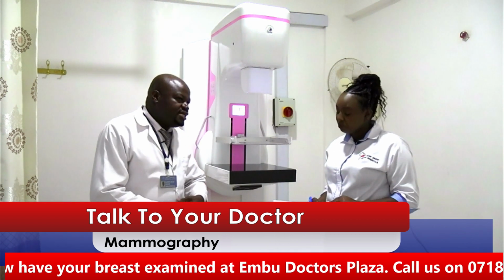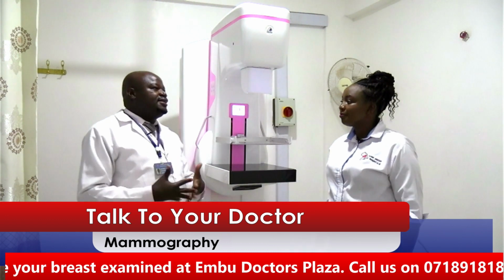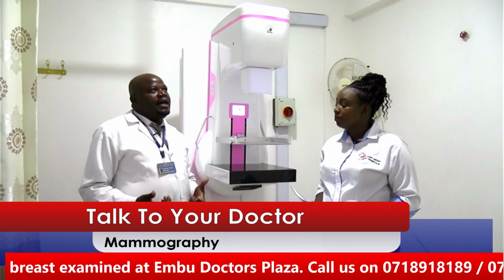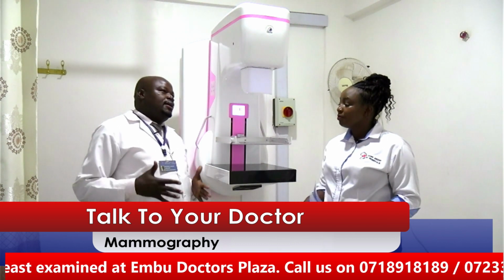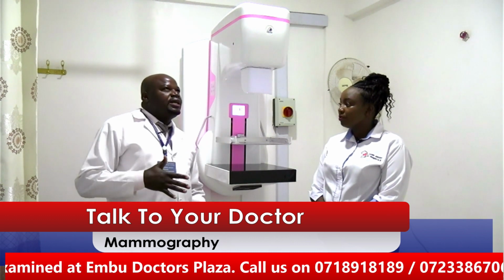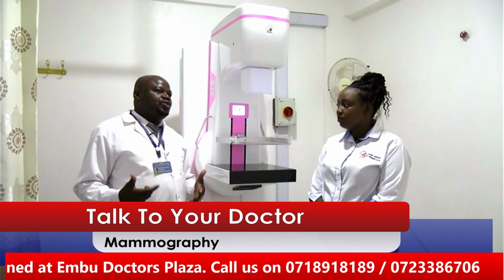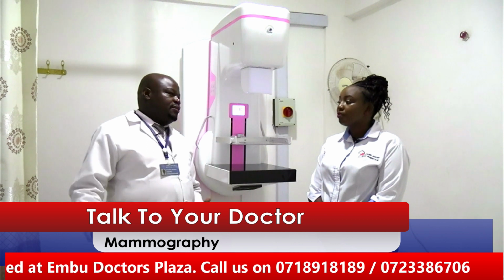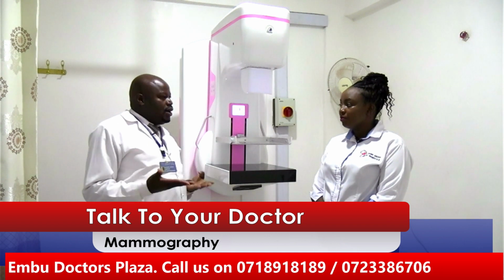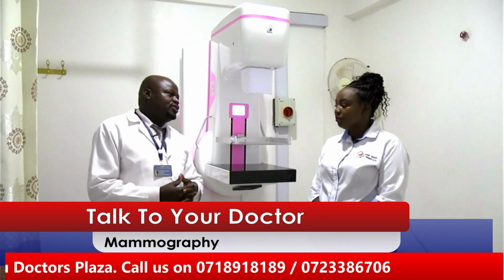It is important that a patient discuss with their doctor about their breast condition or breast feeling, breast signs. So for you to prepare, it is important to note that it is not good to do the examination 1 week before your menstrual periods. But you can do it, we usually recommend our patient to do it 1 week after the periods, because before, the breasts are tender. So at that time, the patient's breasts are okay to be compressed during the procedure. So that's the only preparation that we carry out for mammogram.